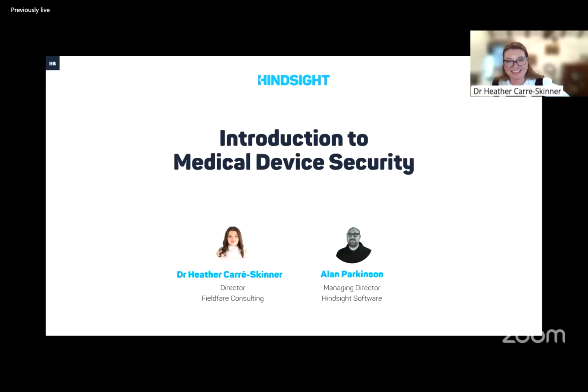So on usability, if you're in SaMD and it's going onto somebody's mobile phone, you might want to start thinking about whether there are some security checks that we can do, making sure that the phone hasn't been jailbroken or doesn't have malware on it. You can start to think about those. There's going to be some high profile incidents. We're going to get new guidance at some point.